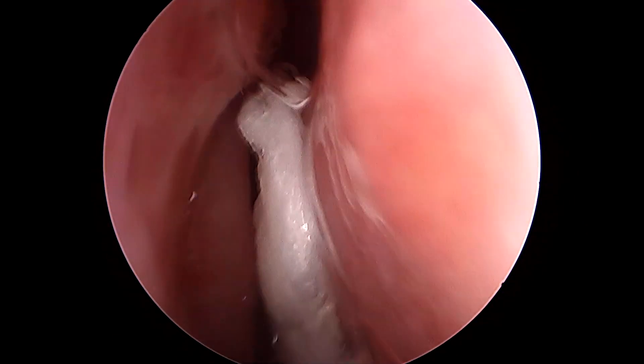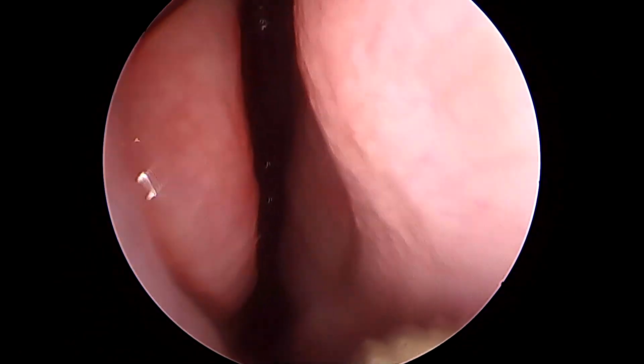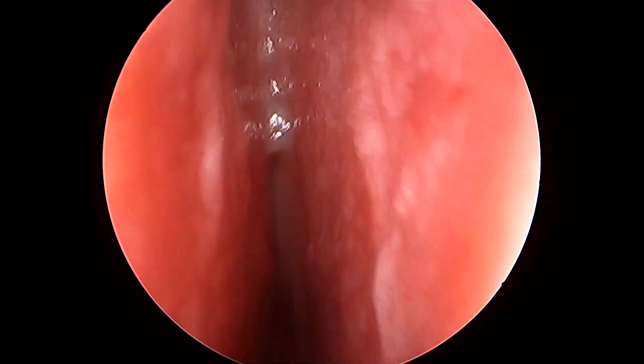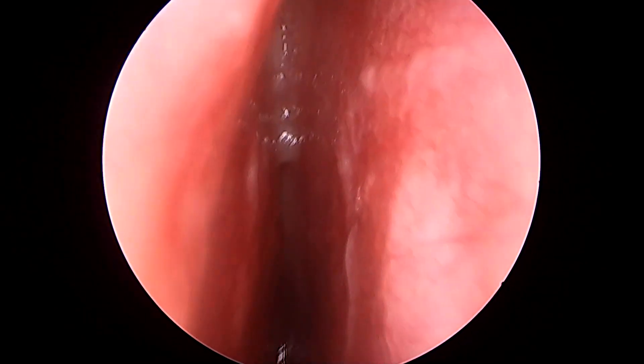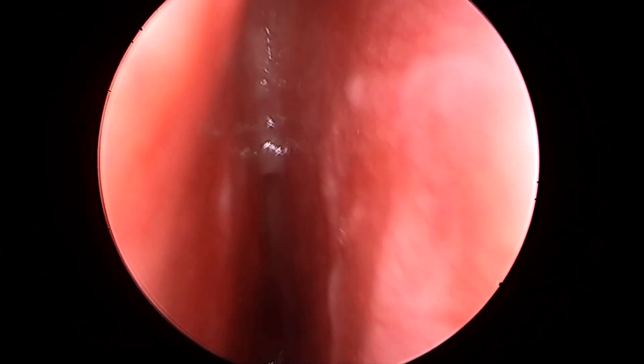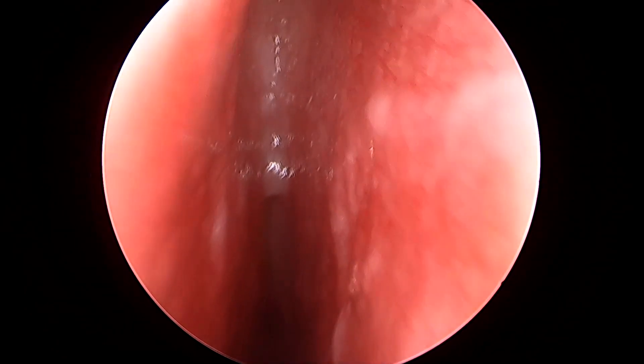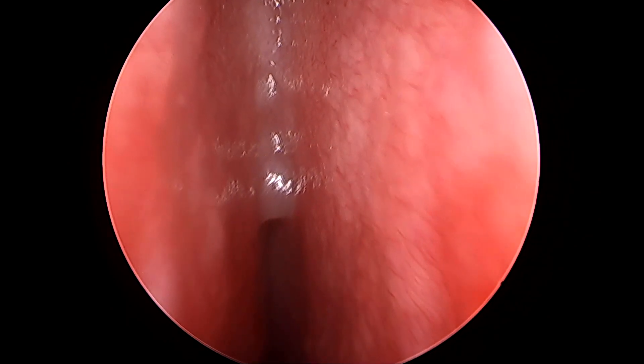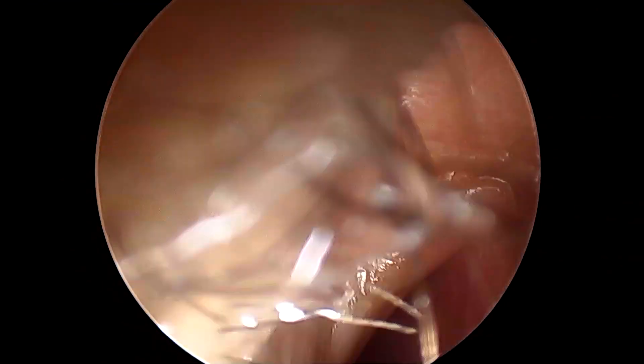I'm going to remove that nasal patty now, and once removed you'll be able to see there is enough space for the endoscope to go inside and the patient will have no pain. You can see there's immense space and a small smooth shiny glistening surface, polyp-like structure up there — that's the cribriform plate area, and that is nothing but a pseudomeningocele, that is the dura along with the arachnoid popping out through the patient's cribriform plate defect.